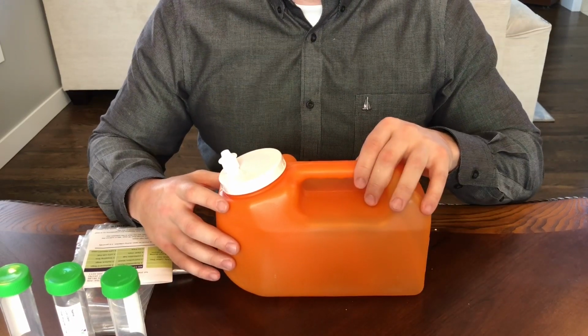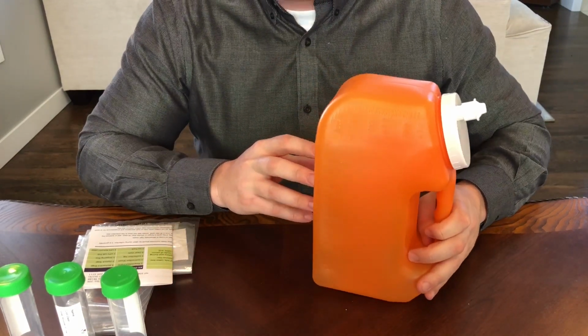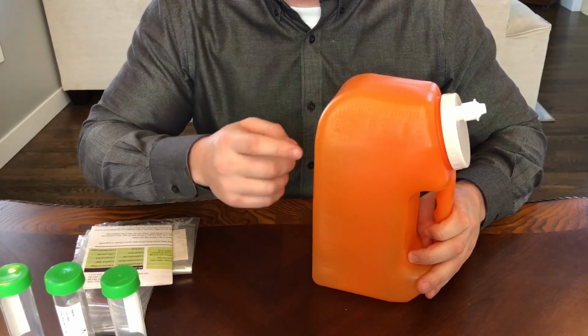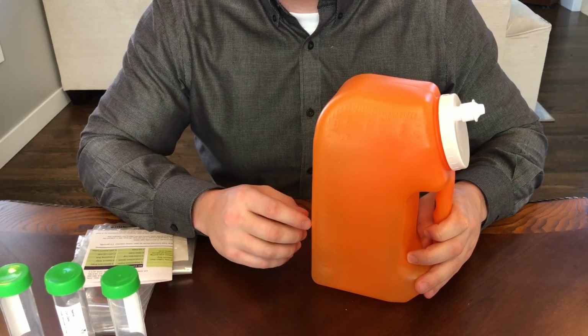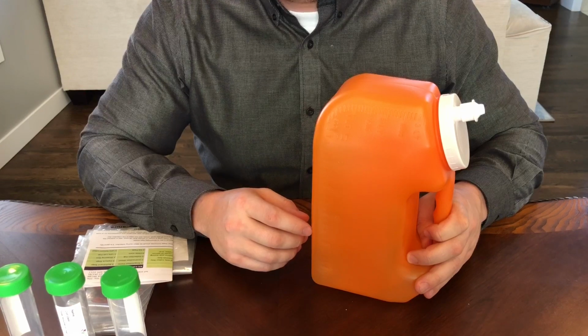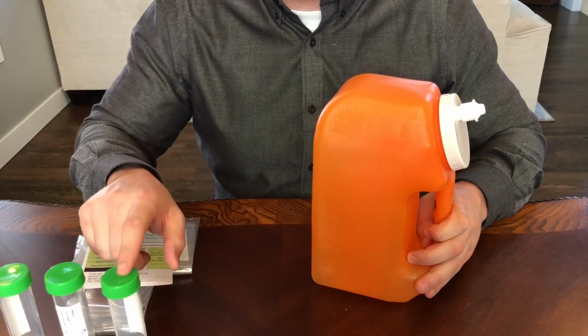Next, you're going to want to record the total volume of the jug by placing the collection jug in an upright position and reading the volume from the scale. Each line on the jug represents 100 milliliters. Record the total volume on the requisition form and on the 3 vials.